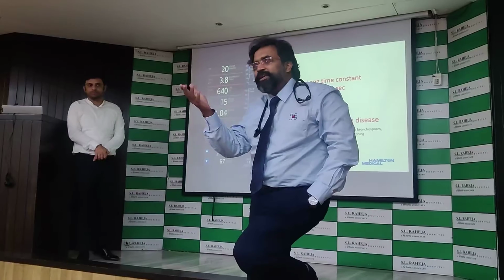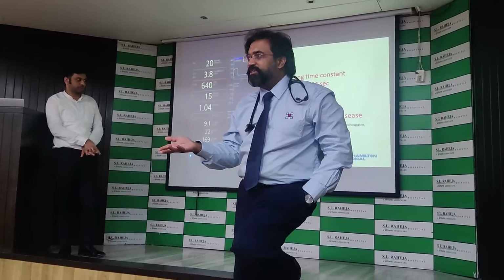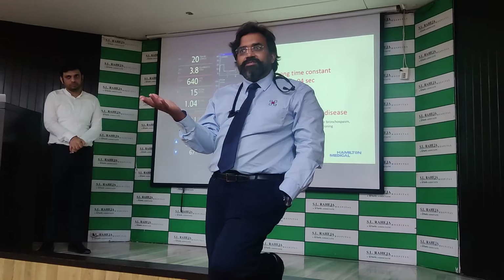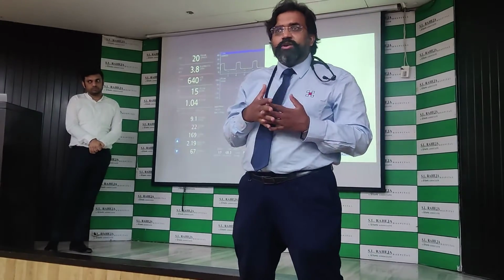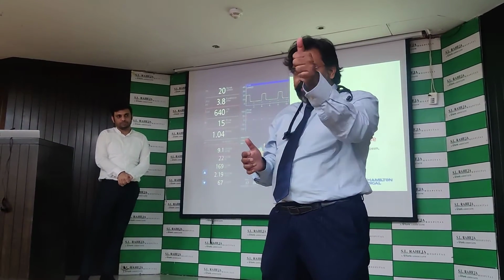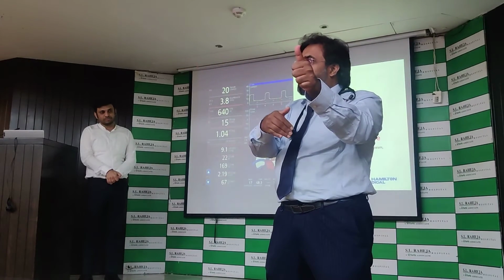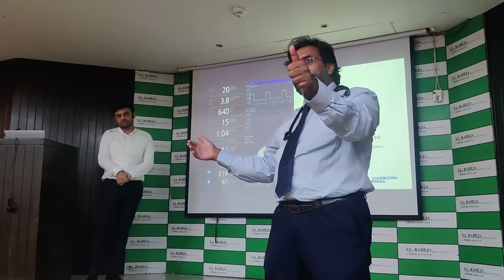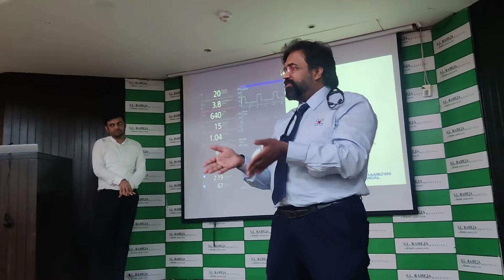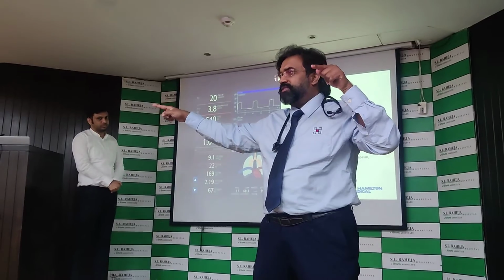Are you understanding? And that's why you must also understand why plateau pressure is not the right pressure. Because time constants are different for each alveolus. Your plateau pressure is monitored when flow is 0. When you press inspiratory hold, you're making the flow 0. There will be certain alveoli that are still filling because they have longer time constants. There will be certain alveoli that have already finished emptying. At the end of the day, your flow is not 0. That is why sometimes in ARDS patients, the plateau pressure takes a very long time before you get a graph that is straight.